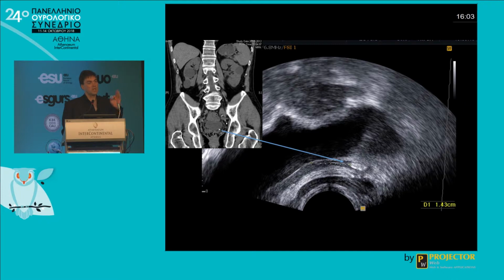Also stones: 99% of all prevesical stones up to the vessel border you can see in ultrasound with this technique very well. You see it here. It's a 5 millimeter stone, 1.5 centimeters from the ostium. If you know this technique, the Kung Fu technique, moving the probe to one side and then the other, you can find it very well.